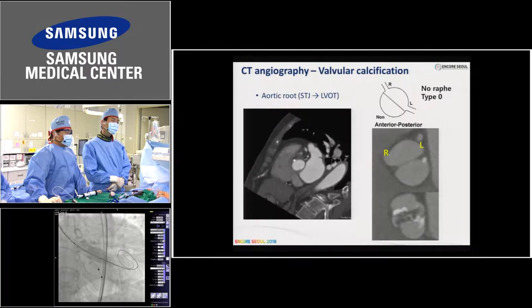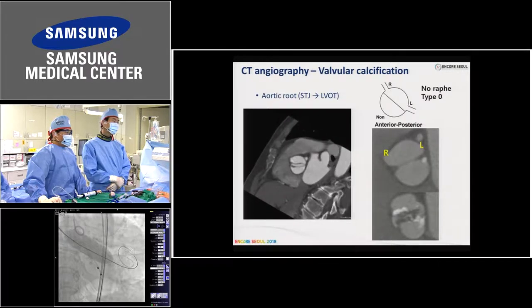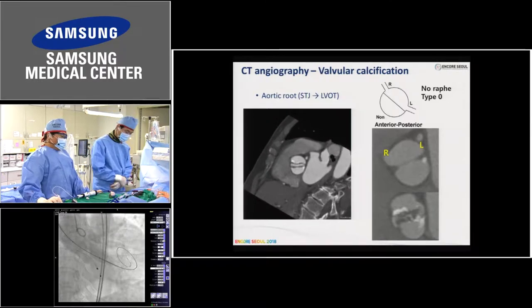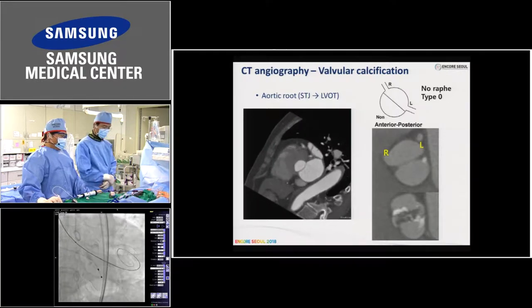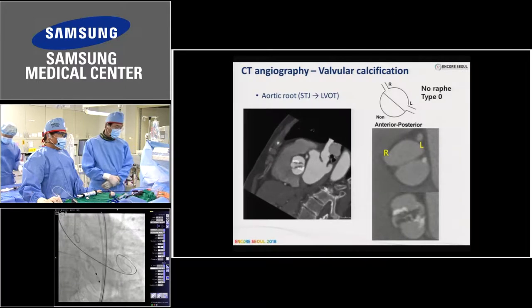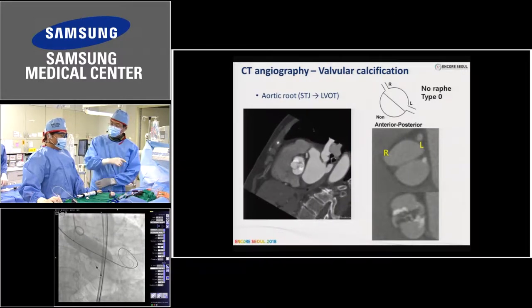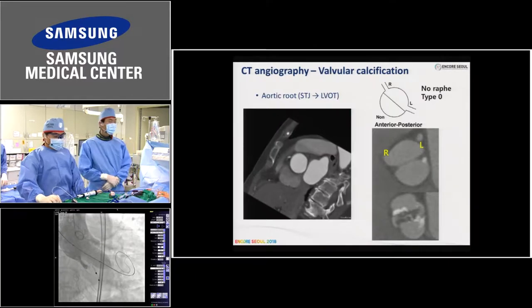The patient is stable, but I would put a wire in the coronary. Yeah, sure, just to make sure, even though there is a very good chance that nothing will happen. So I punctured the left again. Both sides. We need another access to wire the left coronary.